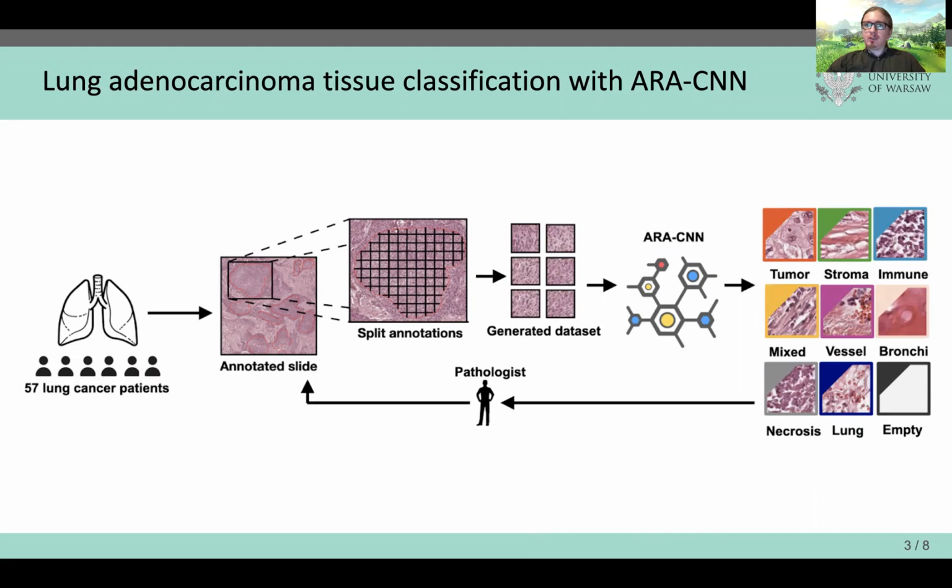We then extracted new patches from these regions, added them to our training dataset, and retrained the model. We repeated this process 3 times, which gave us very good overall classification accuracy. The dataset generated in this process will be published, so the community will be able to train their own classifiers.